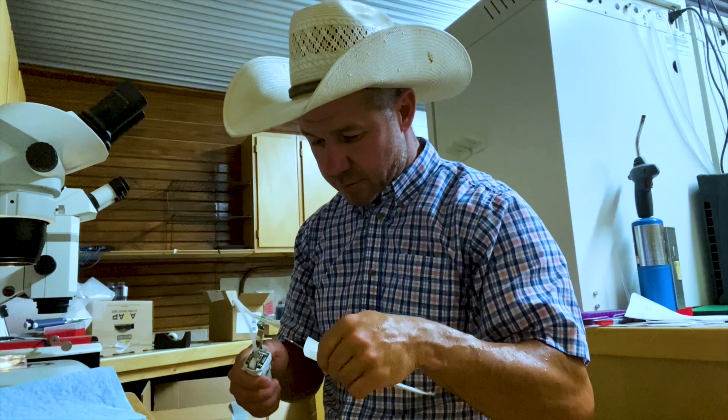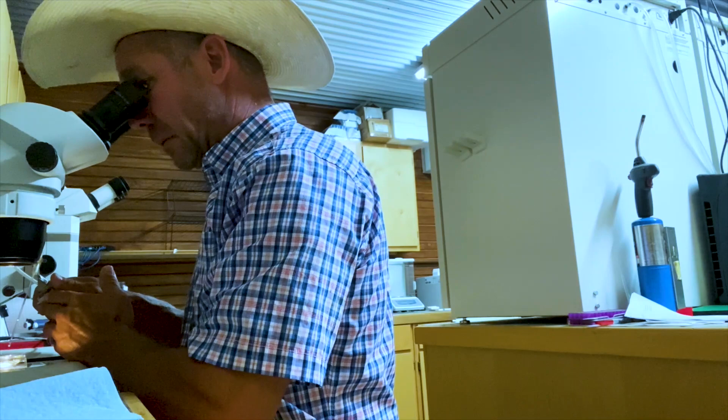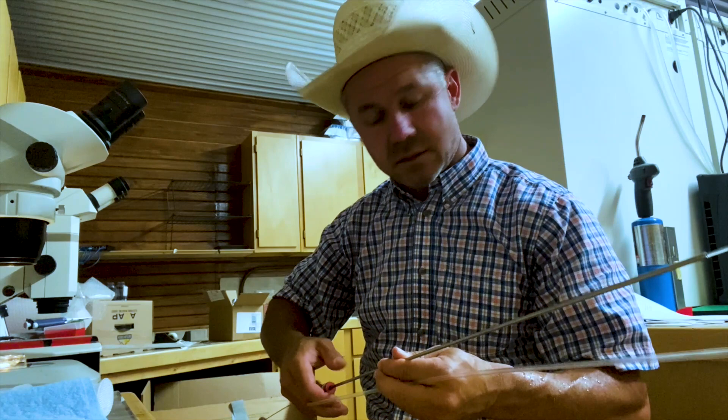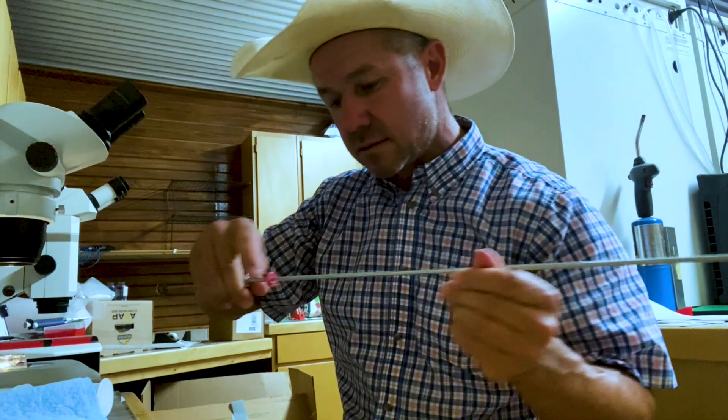Let's load this embryo. Got a straw — these are high-dollar straws for the embryo. We don't want to touch this end, we can touch up here. Our embryo still looks good. Here's what I'm going to do — you see that pocket of fluid? I'm going to put a little pocket of air. The next section has the embryo in it, then a pocket of air, then fluid with the embryo. Then I'll finish it off — got it all the way to the cotton. Now we load it in the gun like this. Don't touch the end. This is a sleeve-side delivery pipette. We lock it in place and lock her down tight.